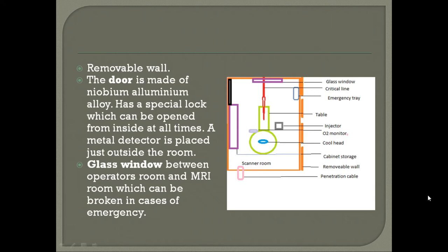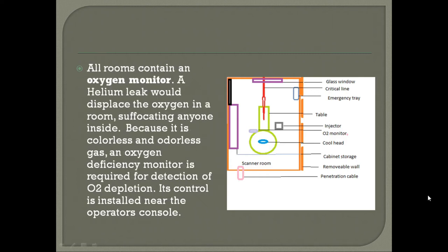The door is made up of a special niobium aluminum alloy. It has a special lock which can be opened from inside at all times. A metal detector is placed just outside the door. A glass window is present between the operator's room and the MR room, which can be broken in cases of emergency.